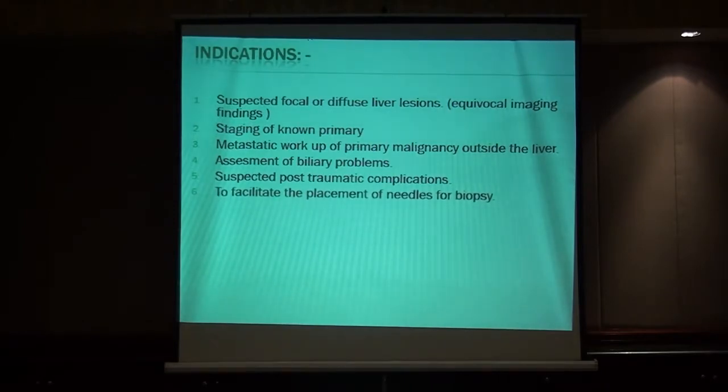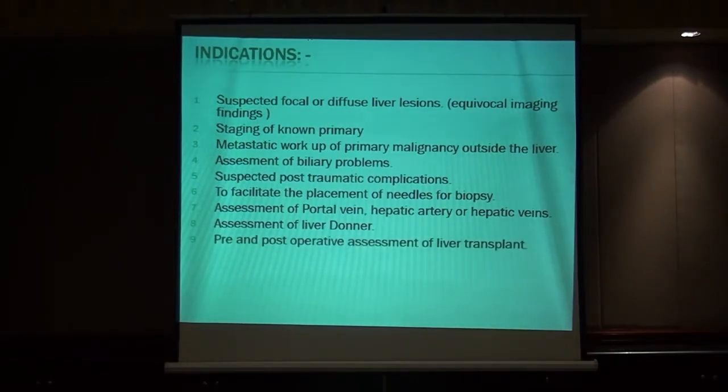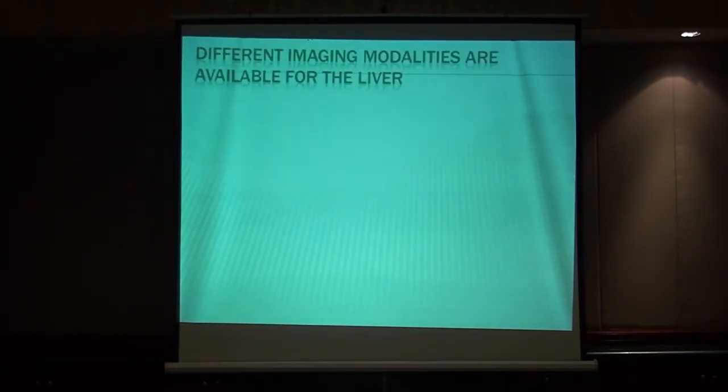To facilitate the placement of needles for biopsy. Assessment of portal vein, hepatic artery, and hepatic veins. Assessment of liver donor. Pre- and post-operative assessment of liver transplant. Follow-up therapy of liver tumors when they are treated with alcohol ablation or radiofrequency ablation, transarterial chemoembolization, or even resection.